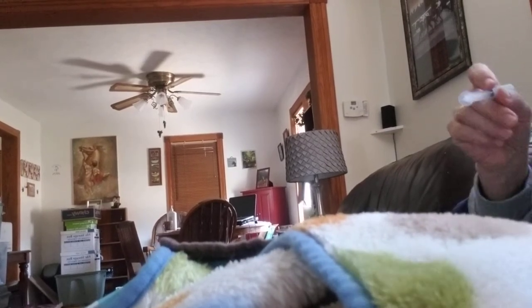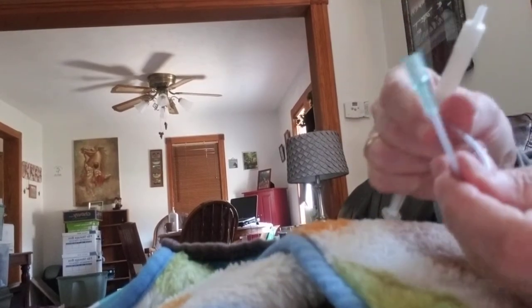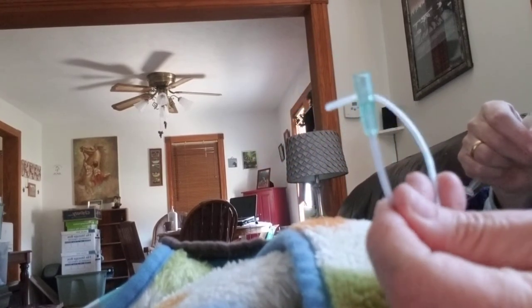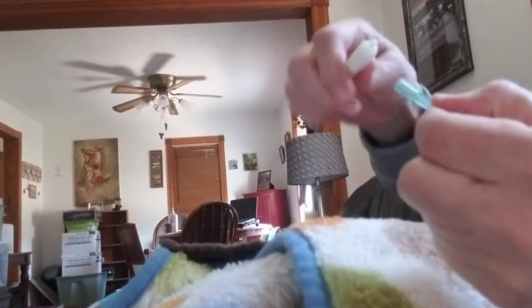And then I took a butterfly child's IV needle insertion and cut off the needle. And that tubing is just about perfect size for a newborn kitten. And then you have the IV port here. You just take off the cap to that, and at this end, you cut off the needle. And then you take your syringe and attach it.